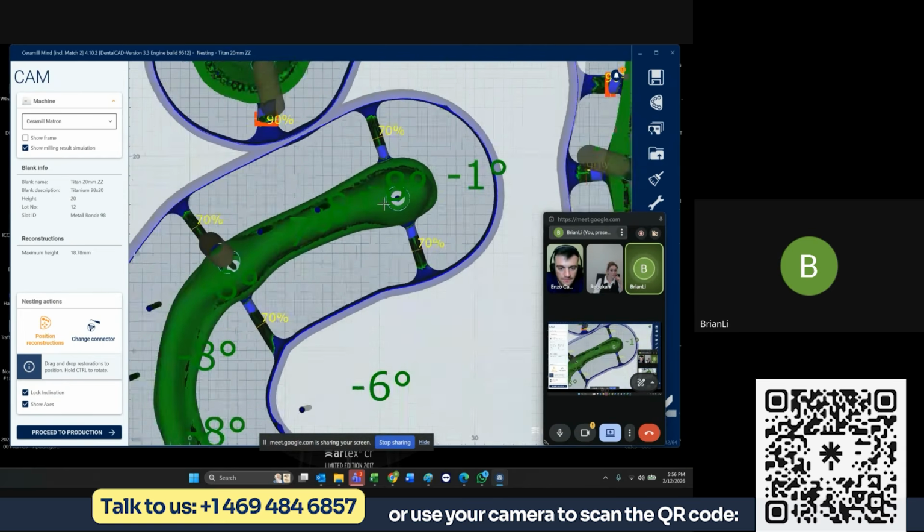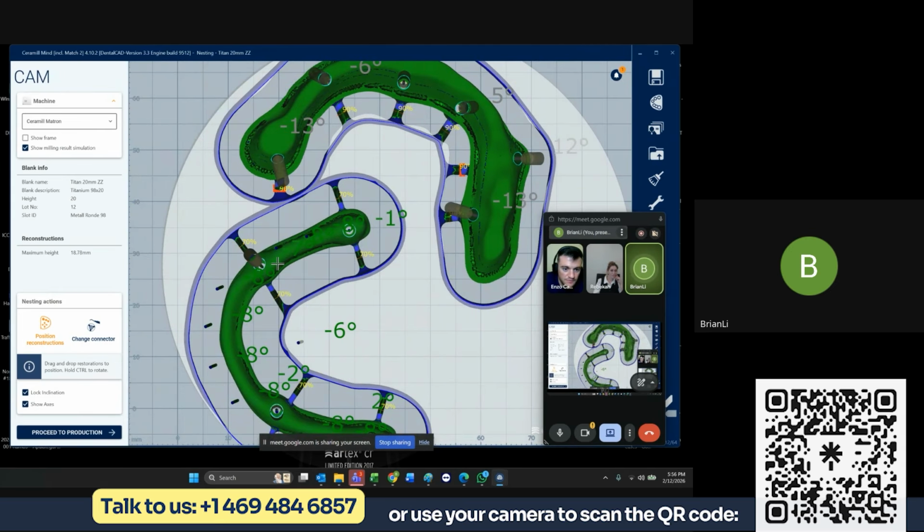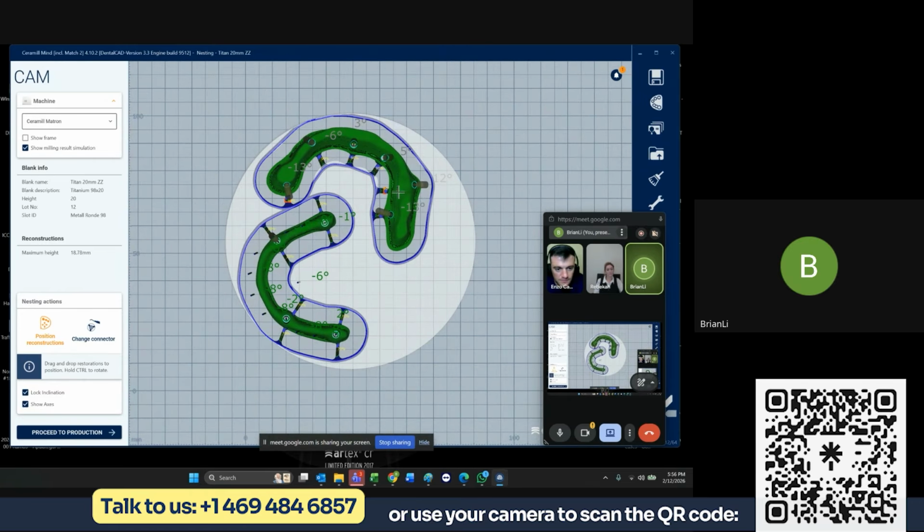So really, in general, when you're nesting, I try to tell people to make right angles, right? Always be perpendicular. If you're putting sprues, don't put a sprue this way or this way, because you create a deep pocket that could introduce problems, whether it's glass ceramics or zirconia or whatever. Always try and keep right angles when you're spruing your restorations.